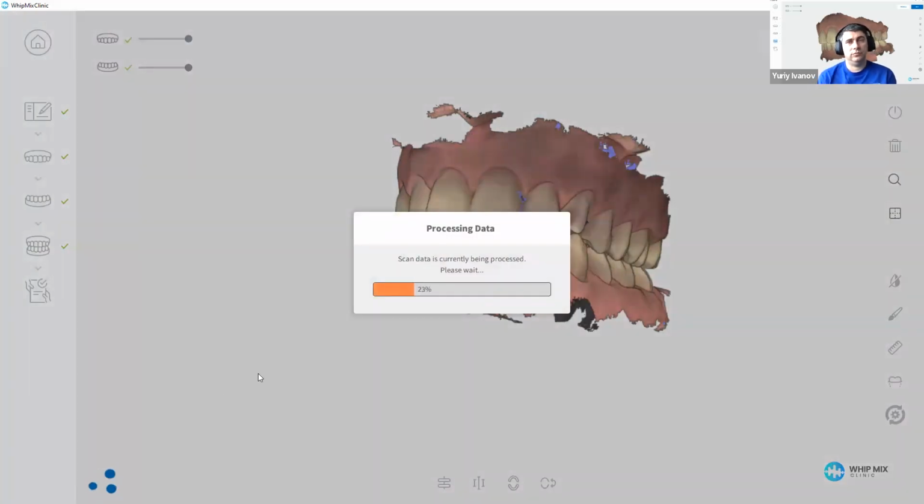Usually it again takes a bit of time, probably 20 seconds, 30 seconds.